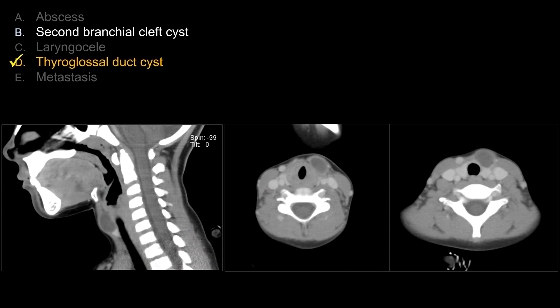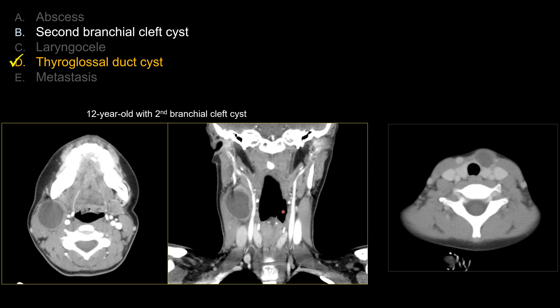Another differential diagnosis is second branchial cleft cyst. Among all branchial cleft cysts, the second type is by far the most common and the one most likely encountered in real life. The classic location, though, is not here — as shown in this 12-year-old with a biopsy-proven second branchial cleft cyst, it is typically medial to the sternocleidomastoid muscle, posterior to the submandibular gland, and lateral to the carotid space.